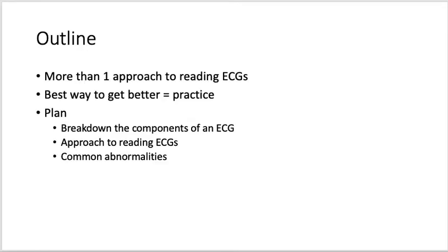I think at this stage it's pretty safe to say that people understand there's more than one way to interpret or read an ECG. I'm going to be putting forward an example of a format that I use while on the wards. You can use this one if you'd like, but I totally understand that if you prefer an alternative method, then this lecture can at least be used to help with reviewing the physiology behind all the waves and all the lines going on in an ECG.